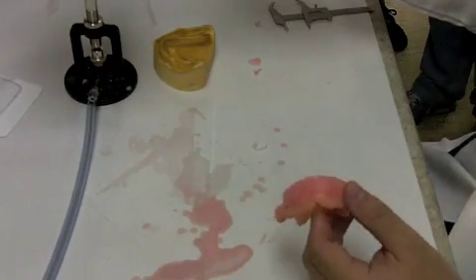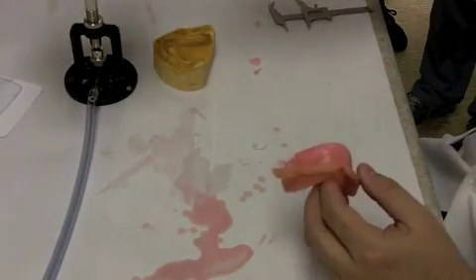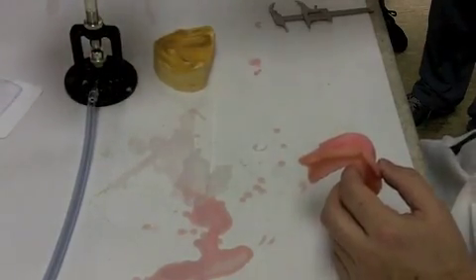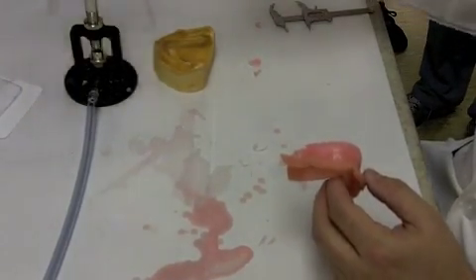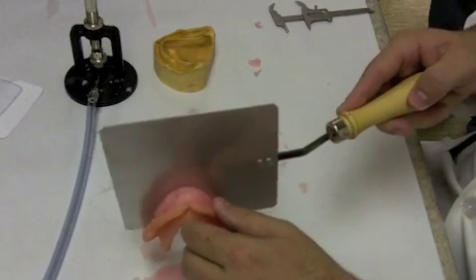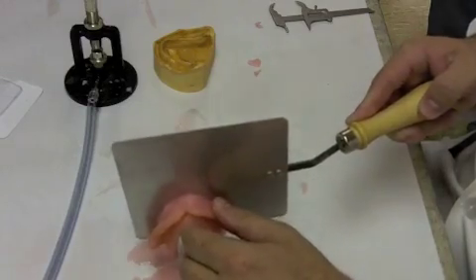Also making sure that whenever we have them count through their 60s or their closest speaking space, that they're not just banging the rims together. But for our simulated project, again, we're using some arbitrary numbers, and we want to establish a 60 millimeter vertical dimension of occlusion, so we want to adjust this rim down to 28 millimeters from the bottom of the typodont. That should give us our total of 60.